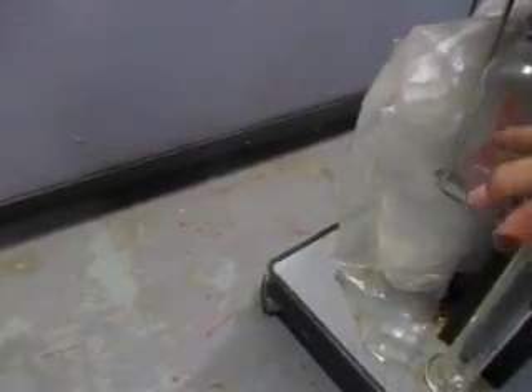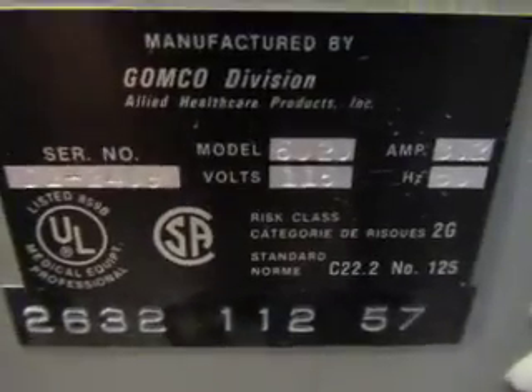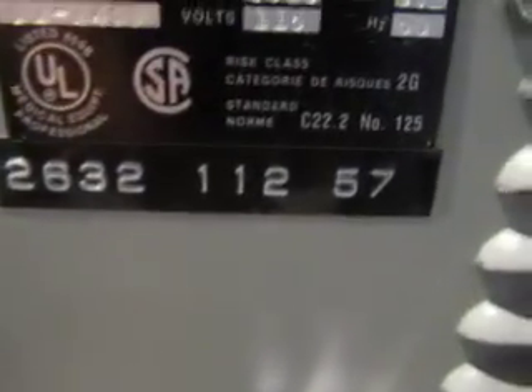A couple of glass canisters here. Here's some specs for you. Model 6020, volts, amps, all that good stuff. Nothing opens up on it. This is in a bag, so I don't know what's under here. Feels like a bottle or something's in here. So there's some type of bottle in here. That'll be included with the item.